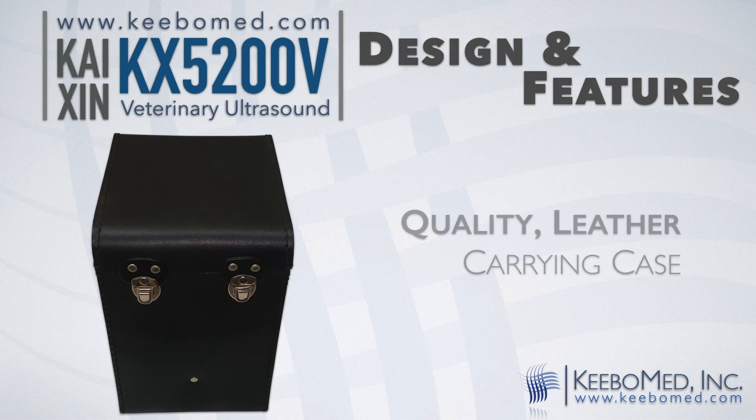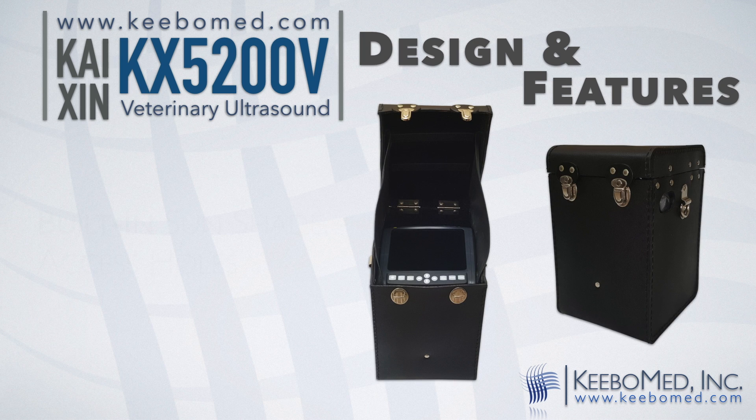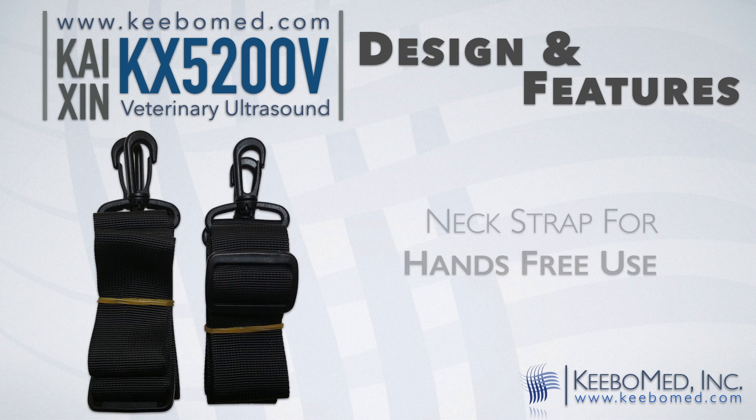It comes in a quality leather case that will hold the ultrasound and all accessories. The KX5200V can be used inside the case. It has a built-in sunshade and access holes for the probe and side ports. A neck strap can also be attached allowing for hands-free use.